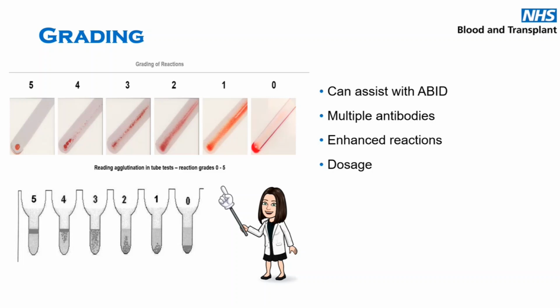Yeah, for that one, actually, according to BSMEDG guidelines, you can only exclude Rh antibodies using an enzyme panel, but it's part of the thing that I'll go through in the talk today. It's having that knowledge and understanding of how things work, and it depends if you use an enzyme IAT or not, but the guidelines do state that it's only supposed to be Rh antibodies which you're allowed to exclude by enzyme.